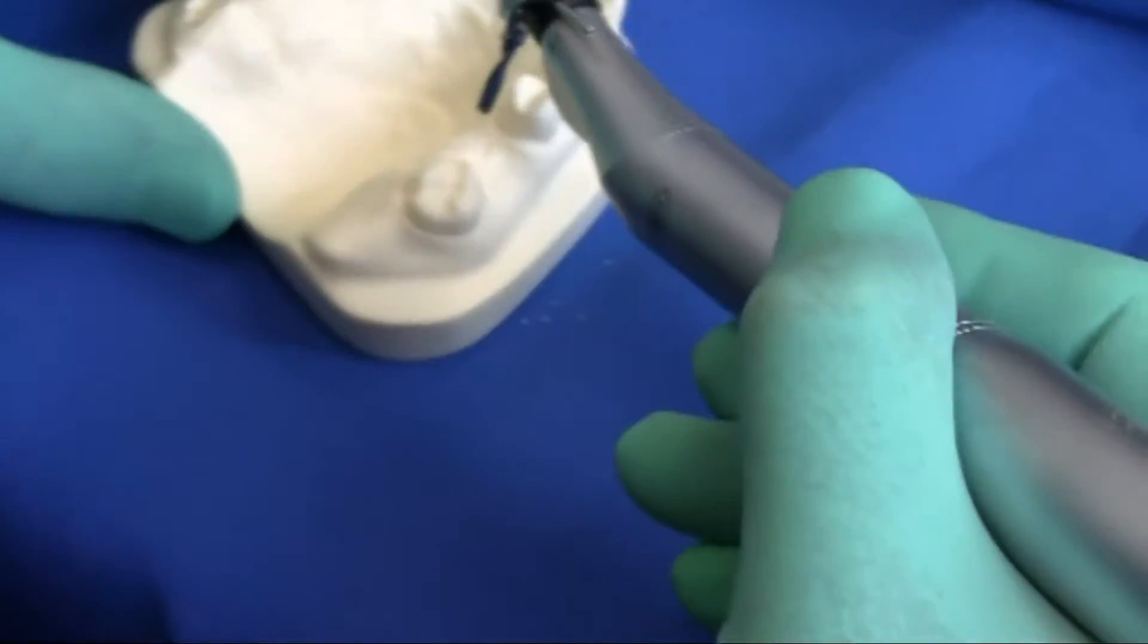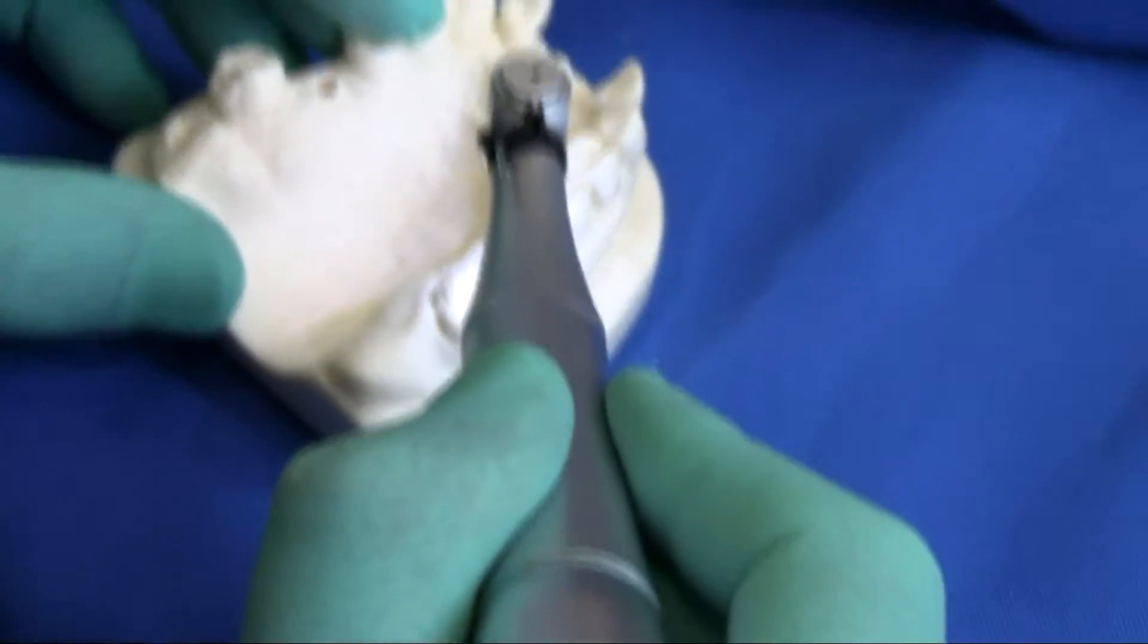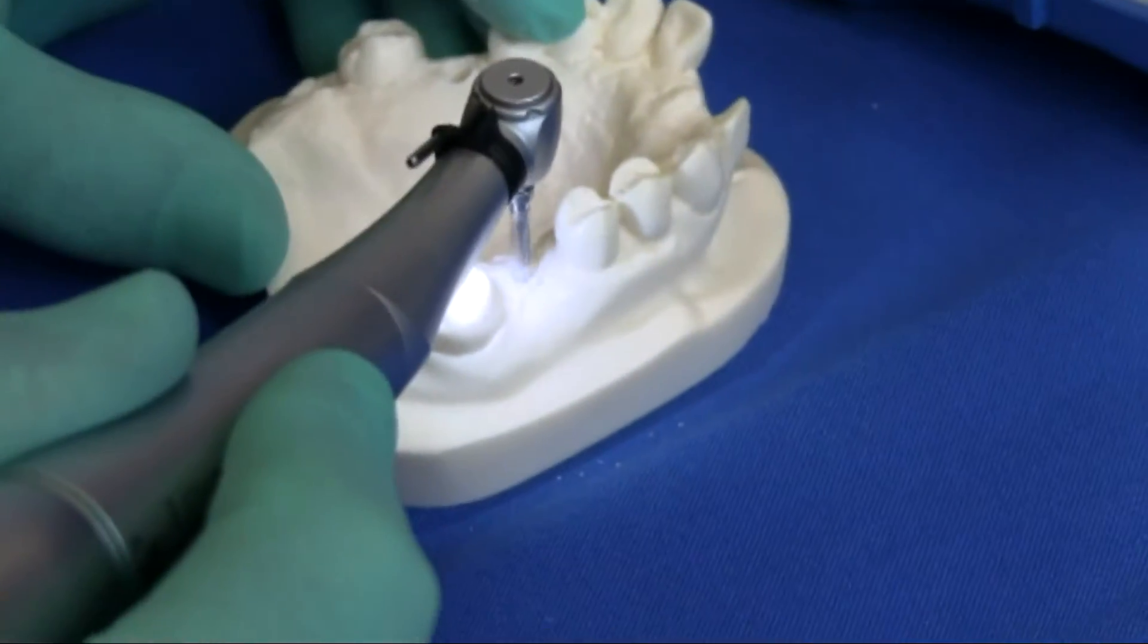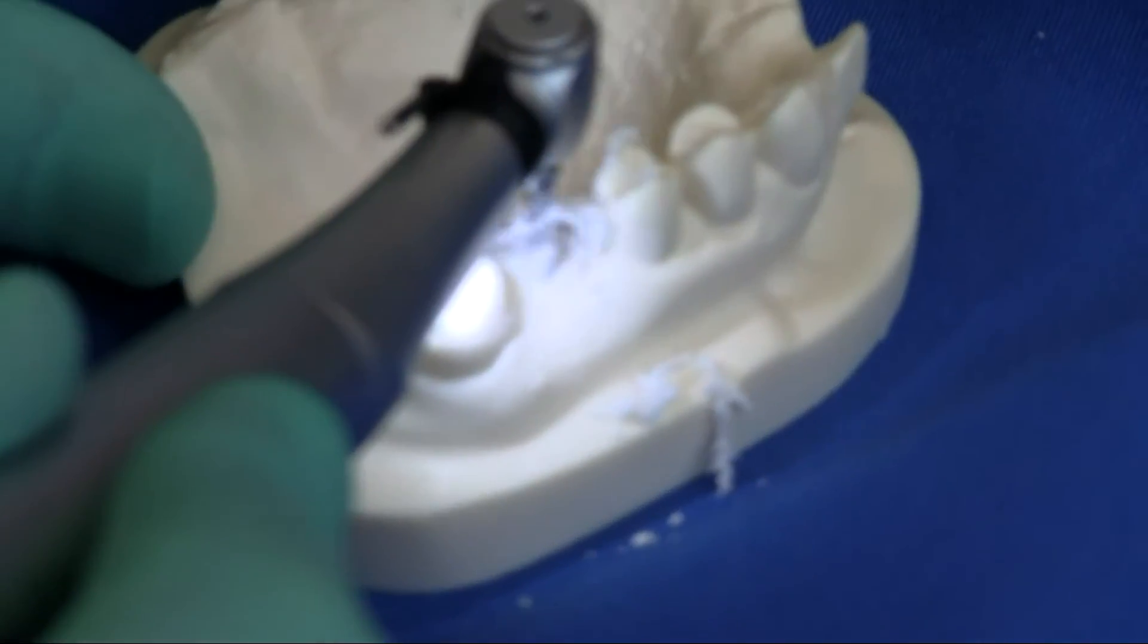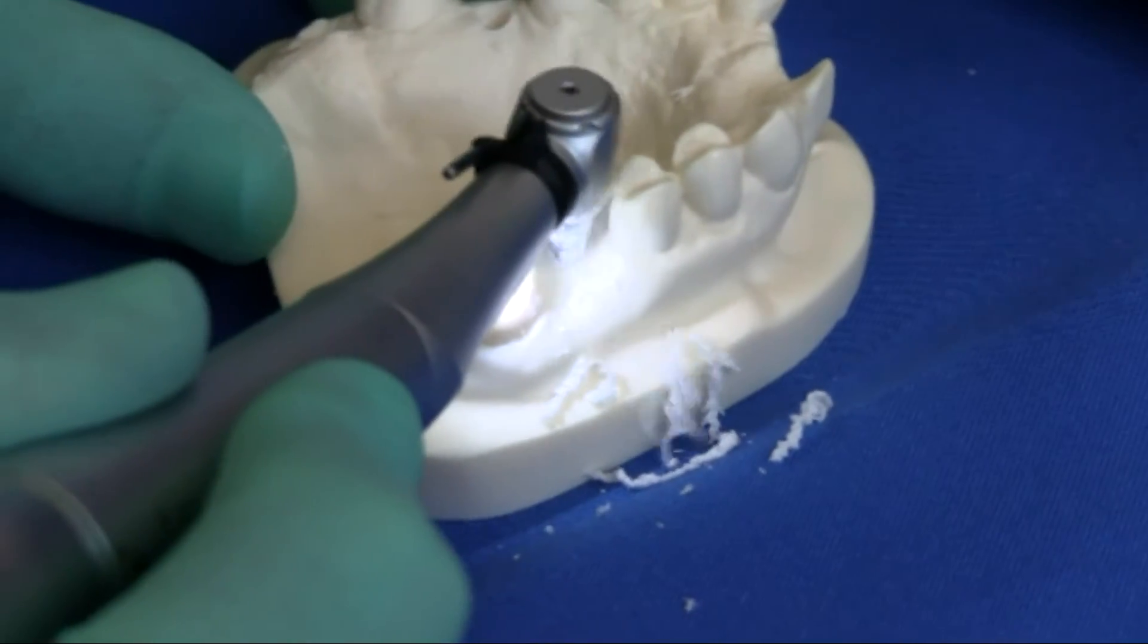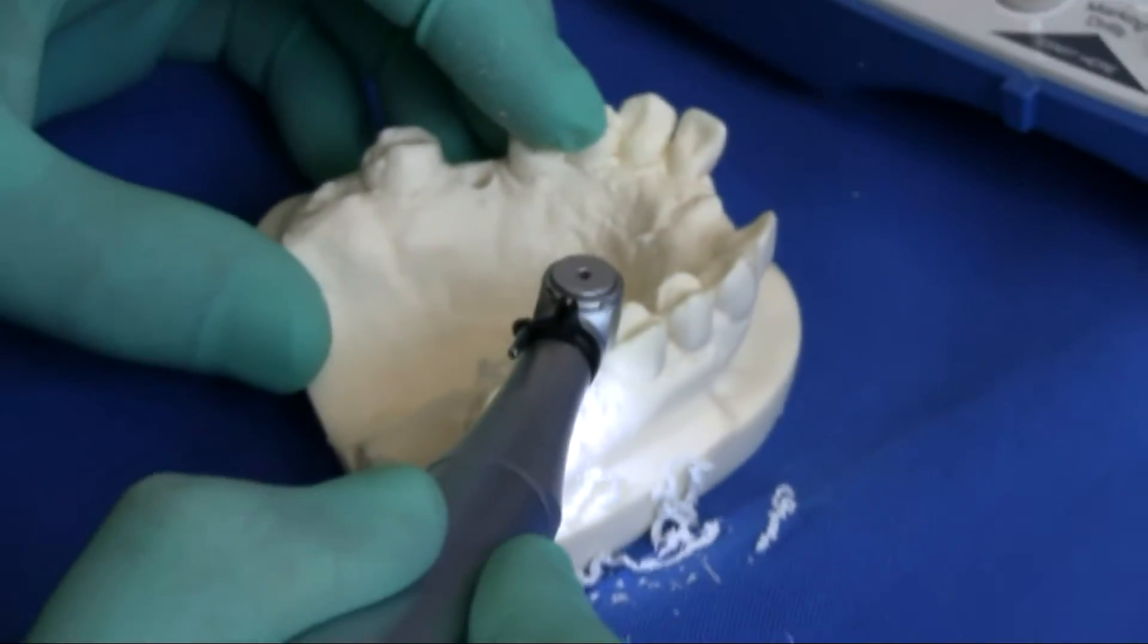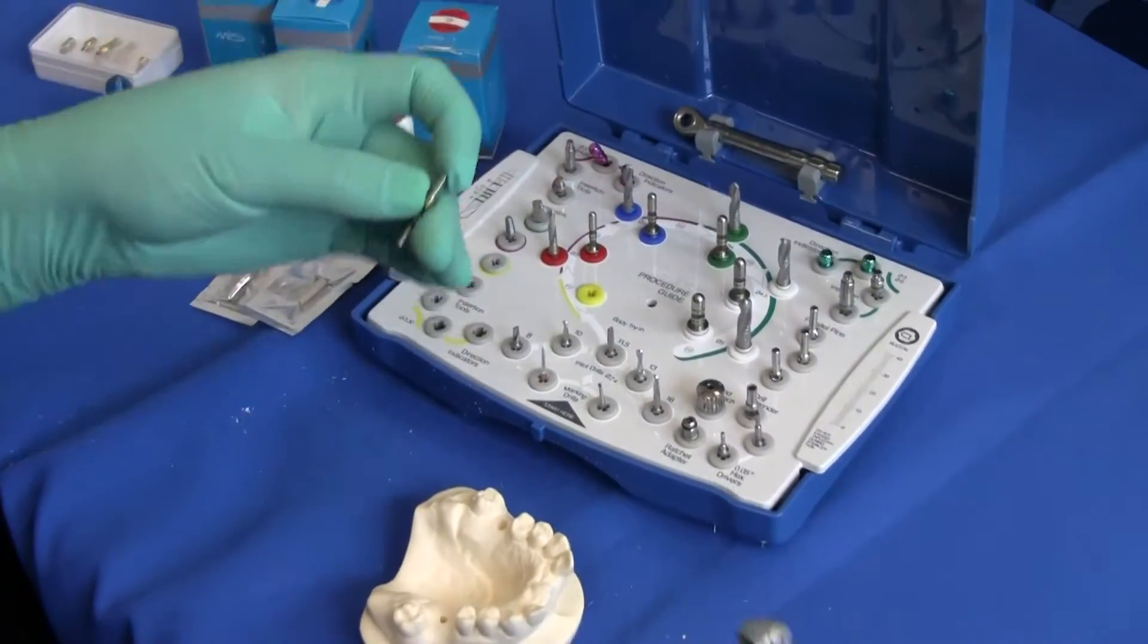In the interest of time, I'm going to drill rather quickly. I can test my depth using the body try-in.